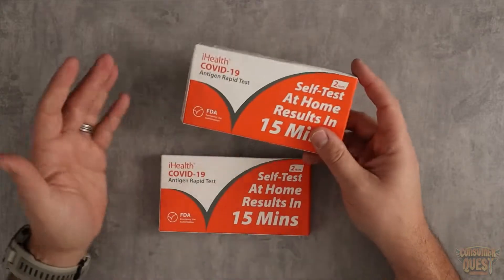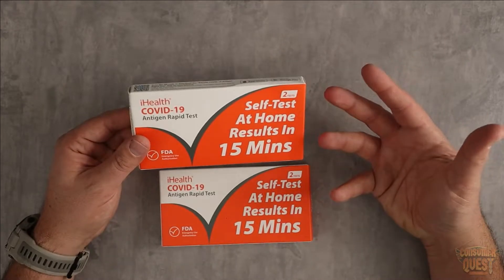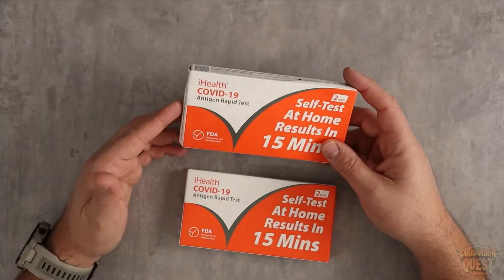I ordered these on Amazon. The price was really hard to beat. They came, took a little bit longer — they didn't have prime shipping, and I think that's mostly because of stock issues. But they got here and now I have four tests. They come in a packet of two, which is very convenient.